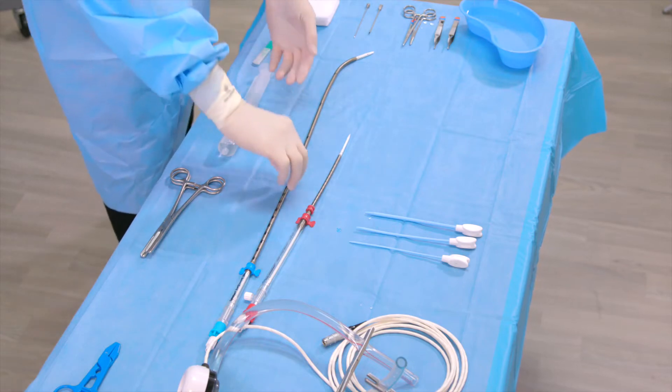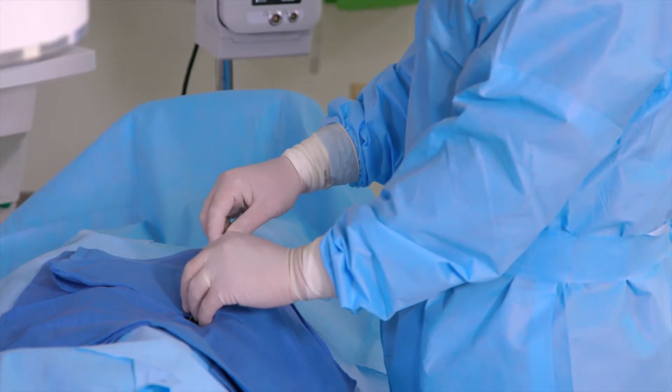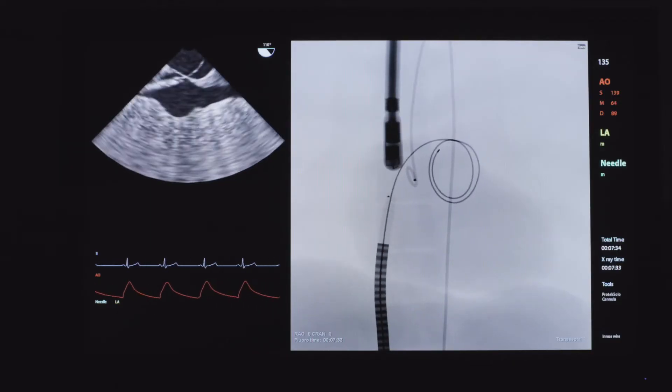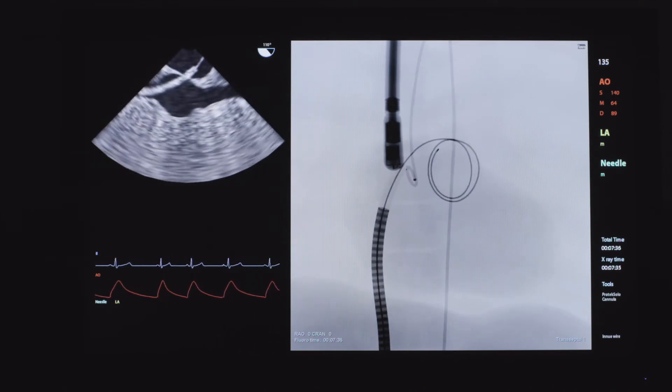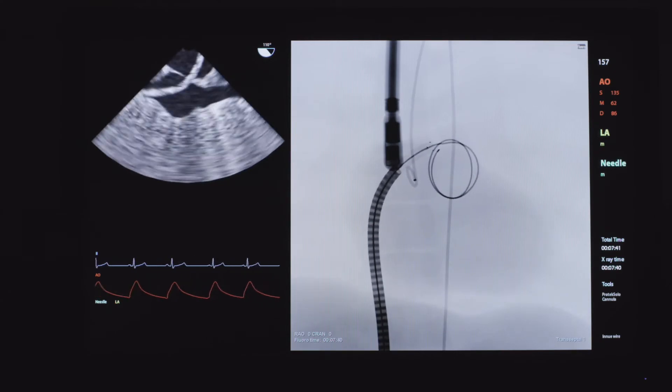Insert the introducer cannula assembly over the guide wire into the left atrium. Confirm the position of the tip of the transeptal cannula inside the left atrium using techniques such as pressure transducing, O2 saturation, and echocardiography.